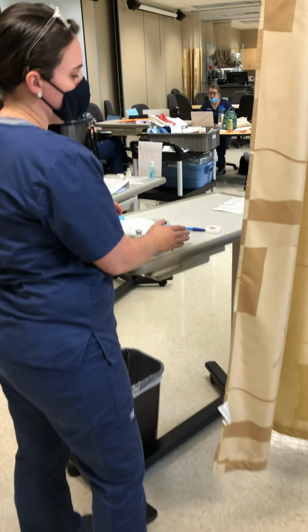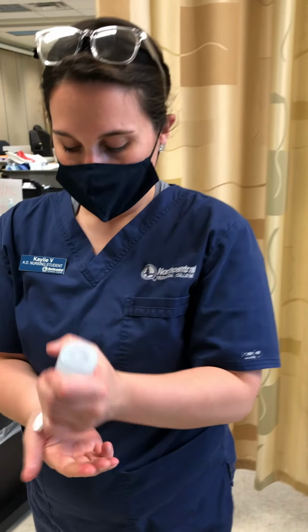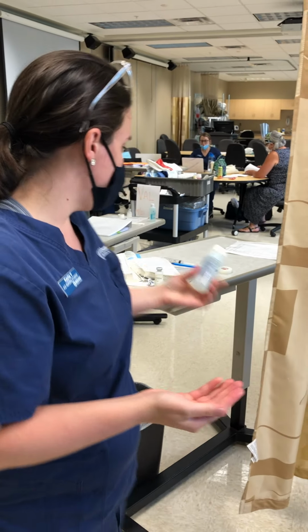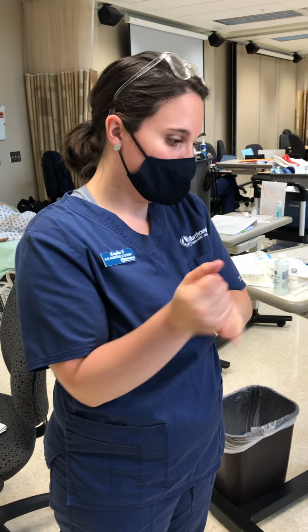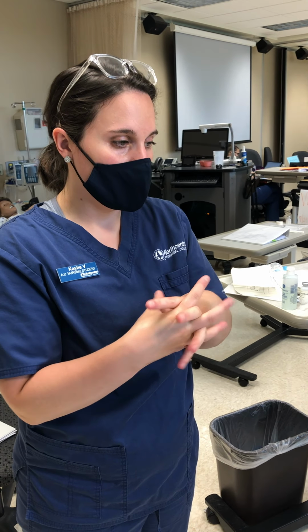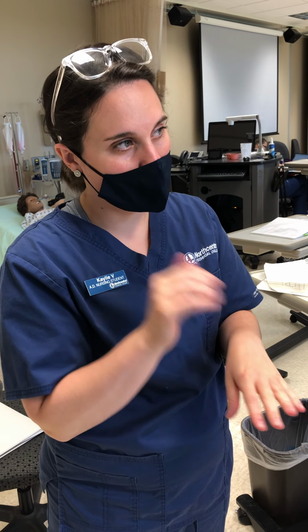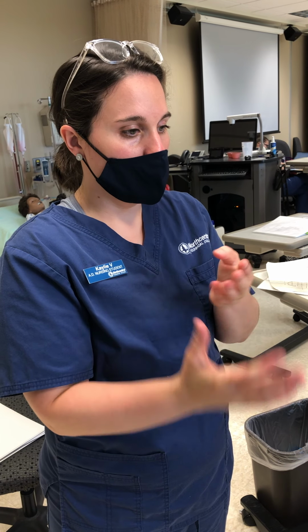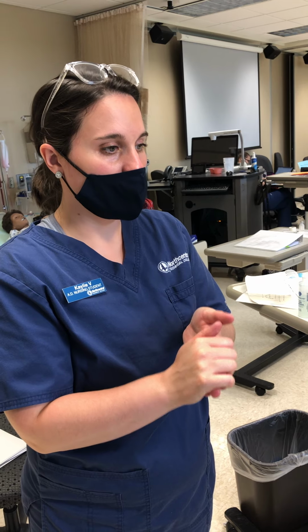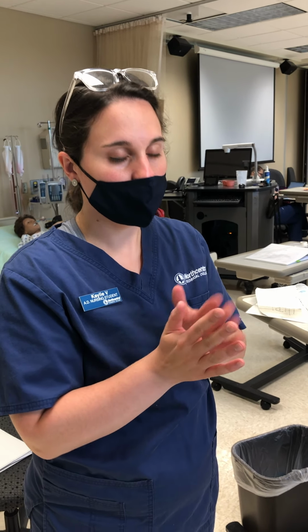I'd wash my hands, and then I would document, pretend I'm out of the room. I would document the date and time that the medication was given, how much was given, that it was administered via IV push, and that it was administered over 1 minute. I would also document that normal saline was used to flush and how much normal saline, which is 20 mLs. I'd also document the patient's reaction, and my assessment findings when I checked the dressing. That's it.